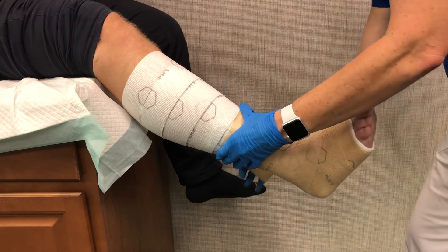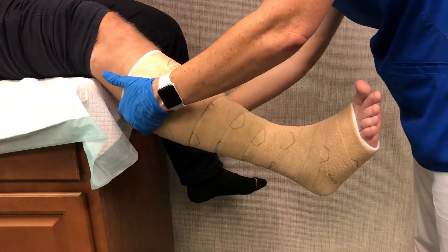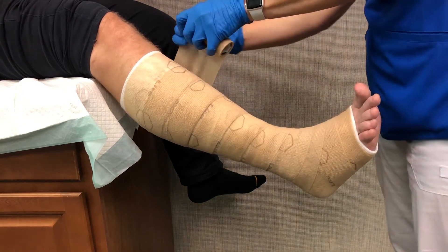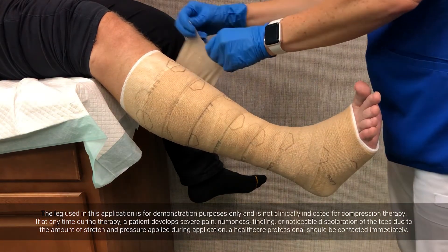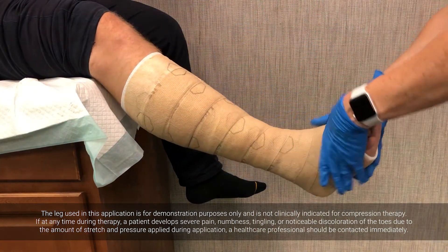Once above the ankle, wrap the compression bandage around the leg using a spiral technique with a 50% overlap. In order to reach the optimum level of compression, stretch the bandage until the indicator has reached a regular hexagon. Tear off any excess material beneath the tibial tuberosity and about 2 centimeters below the fibular head. Carefully press the bandage onto the entire leg as this will ensure optimal cohesion. Additional fixation is not necessary, but tape may be used if desired.